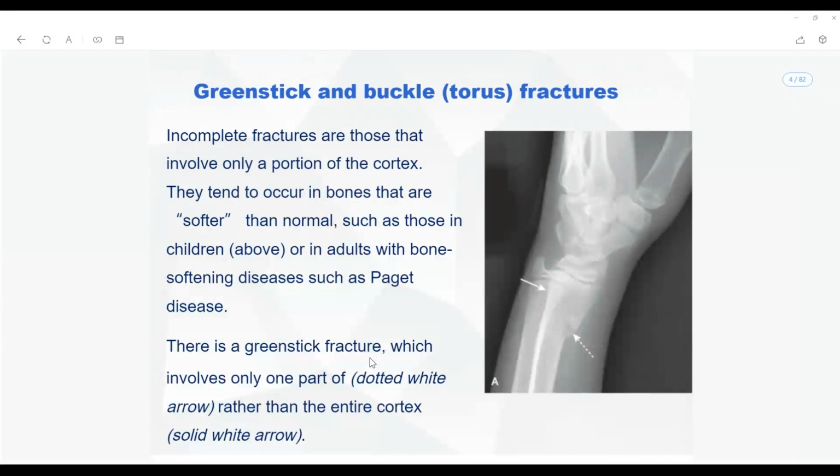Either you note them down, because it takes a lot of time for me to type them. Okay, the first thing, whenever you suspect a fracture or a problem related to the musculoskeletal system, a joint, you have to involve the symmetry.